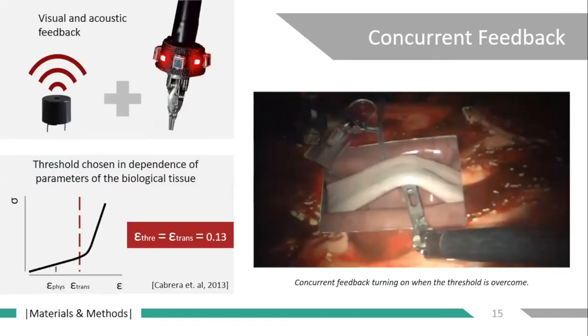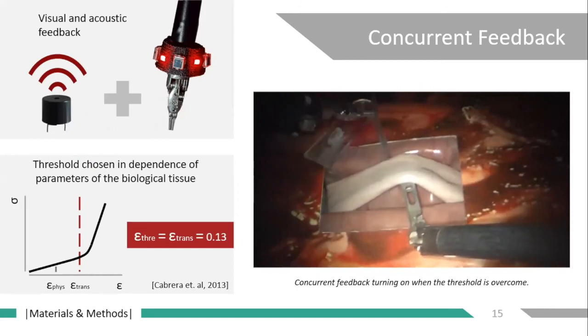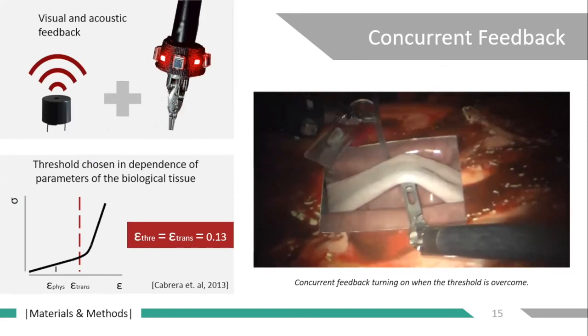And we gave concurrent feedback, both in a visual and acoustic manner, like in the operation game. And basically, feedback was given when a certain threshold was overcome. And this threshold was chosen on the basis of mechanical parameters of the real pulmonary vein.